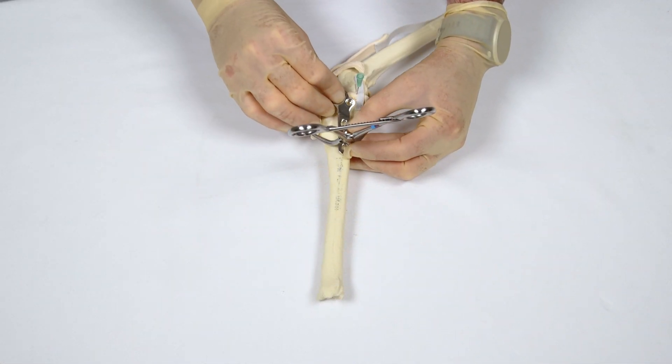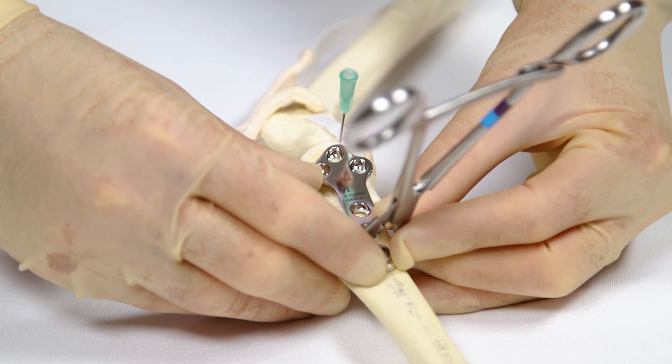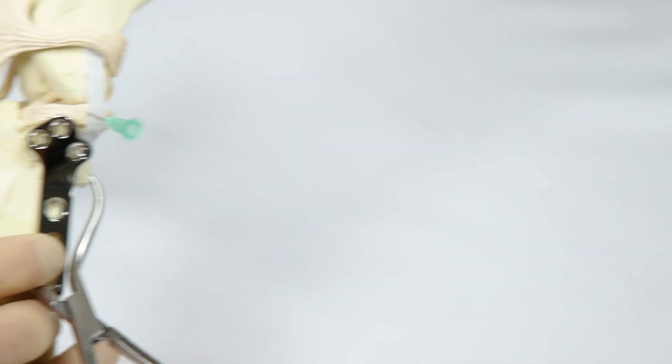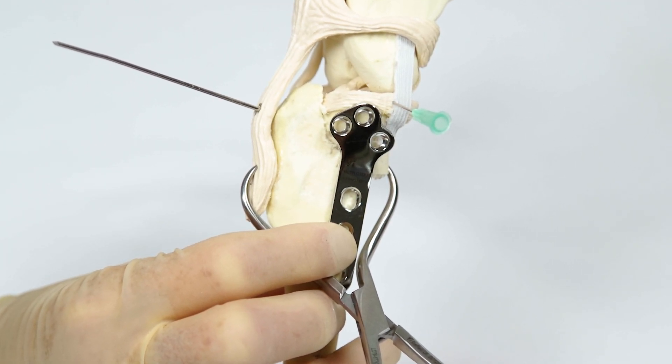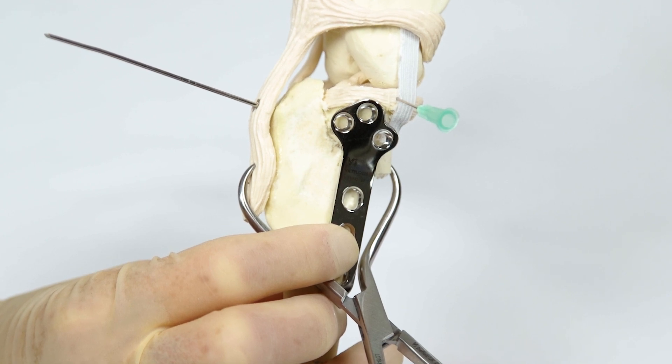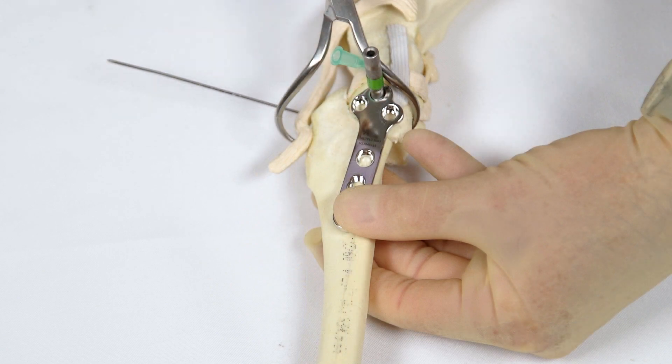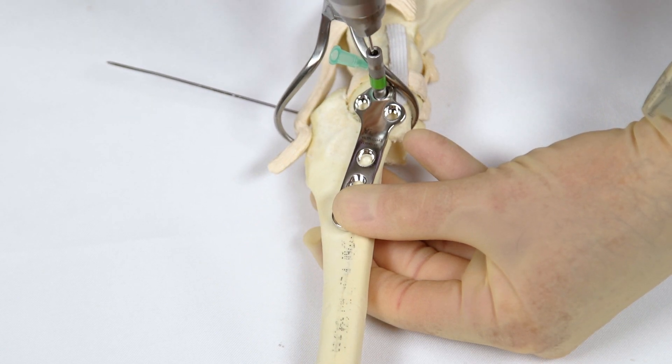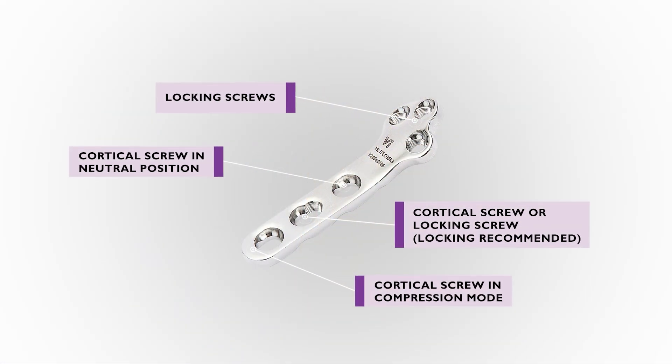Plate position and fit is now checked. The plate should fit flat distally on the tibial diaphysis, but there may be a gap between the plate head and the tibial plateau. The head should sit centrally over the tibial plateau segment. Temporary fixation of the plate to the bone can be achieved by placing a K-wire through a locking drill guide. The plate is now placed.